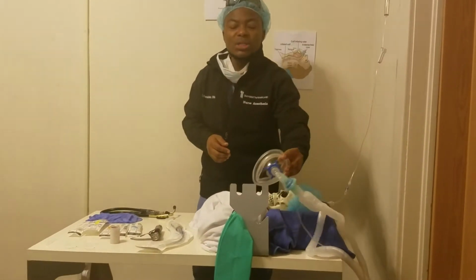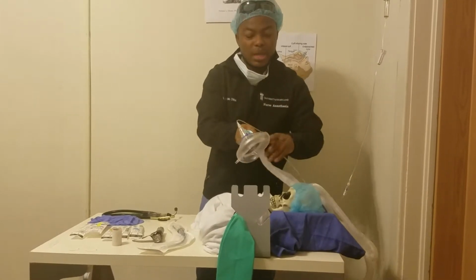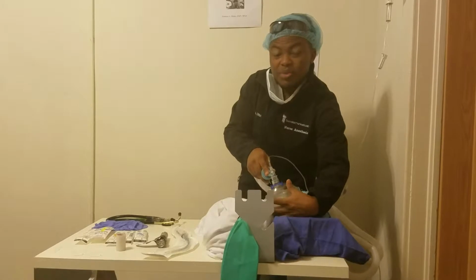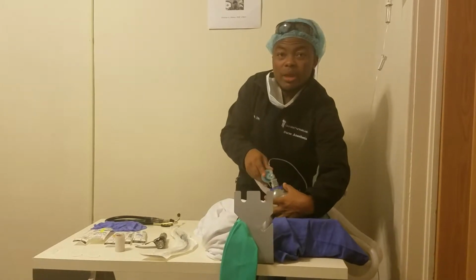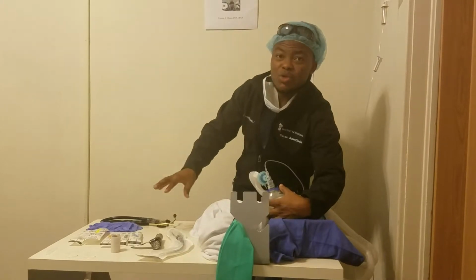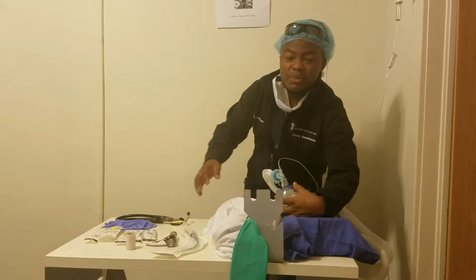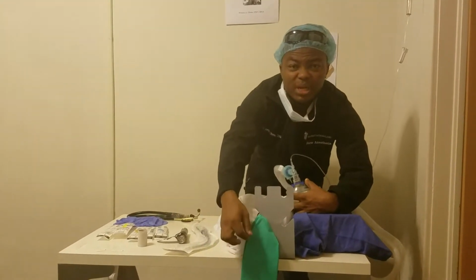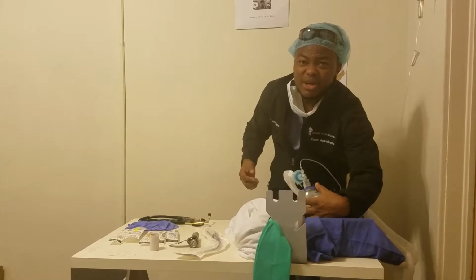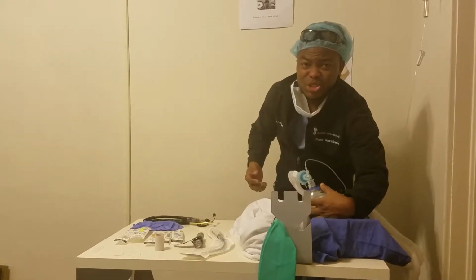We turn our oxygen up to high flows, about 10 liters or more, and then we place the mask on the patient and we help support from under the jaw. Patient may make respiratory efforts at the beginning, but as we begin to put medications in the patient's IV and they begin to drift off to sleep, we will support by squeezing the bag and helping to pre-oxygenate, at the same time getting rid of nitrogen, which is about 78% of air mixture.